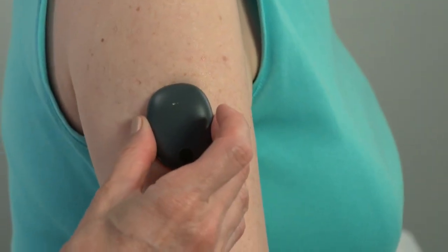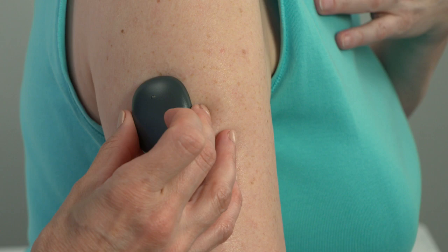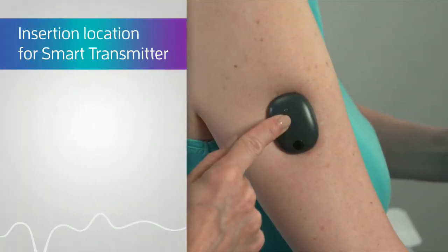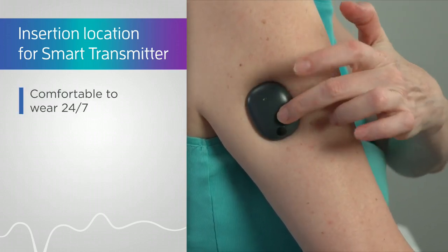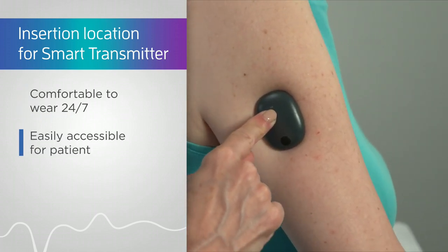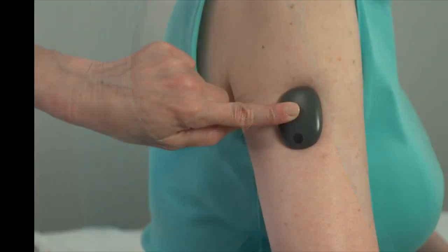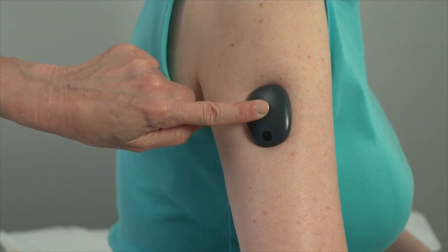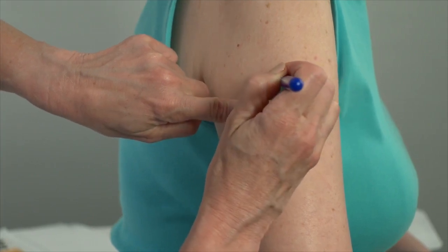With your patient seated on the procedure table, position the smart transmitter on the lateral area of the patient's arm below the deltoid. You want to select an insertion location for the smart transmitter that is comfortable to wear 24/7 for months and be easily accessible for the patient to reach. Also, consider the patient's lifestyle, hobbies, activities, and sports when selecting where the patient will wear the smart transmitter for the months ahead. Once you've selected the position, hold the smart transmitter in place and mark the edges on the skin with a surgical marker.